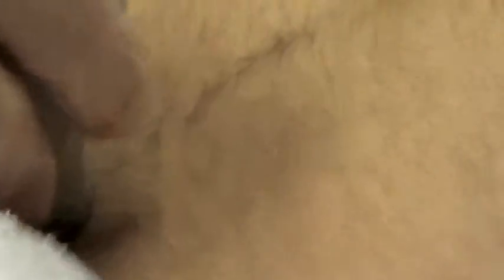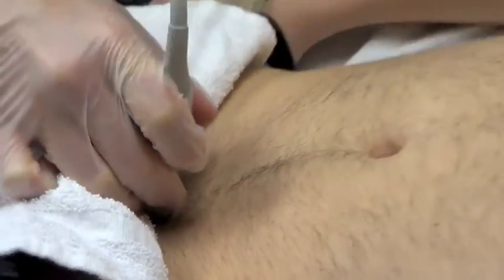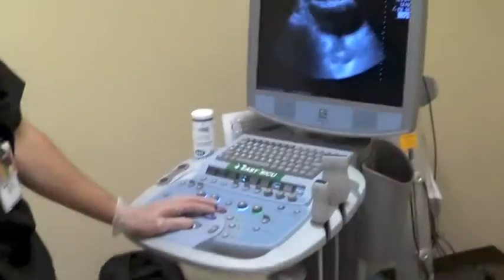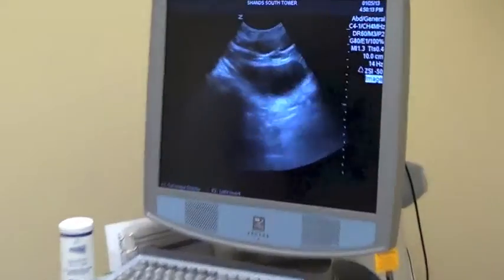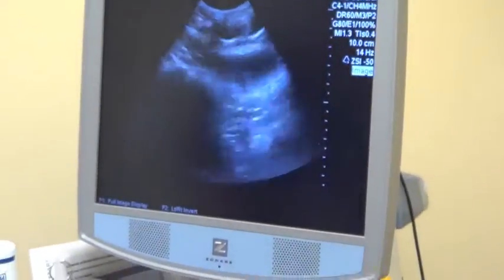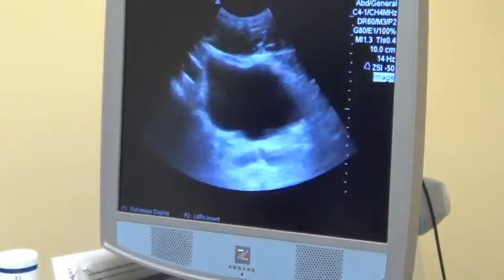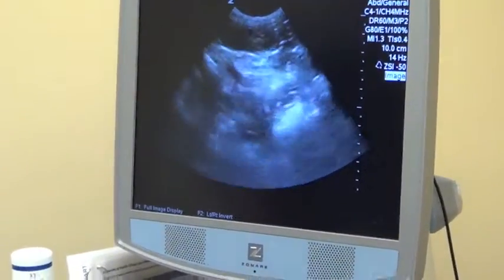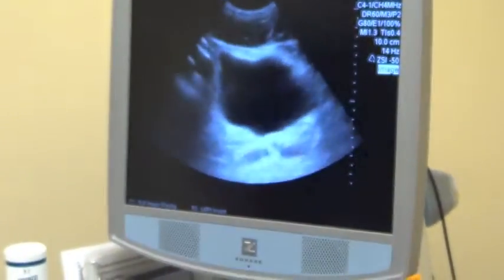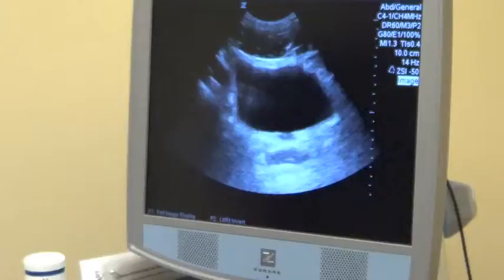We're going to turn the transducer indicator over to the right side of the patient — that's a 90-degree counterclockwise rotation. Then we will scan all the way inferior and all the way superior, evaluating the entire bladder.